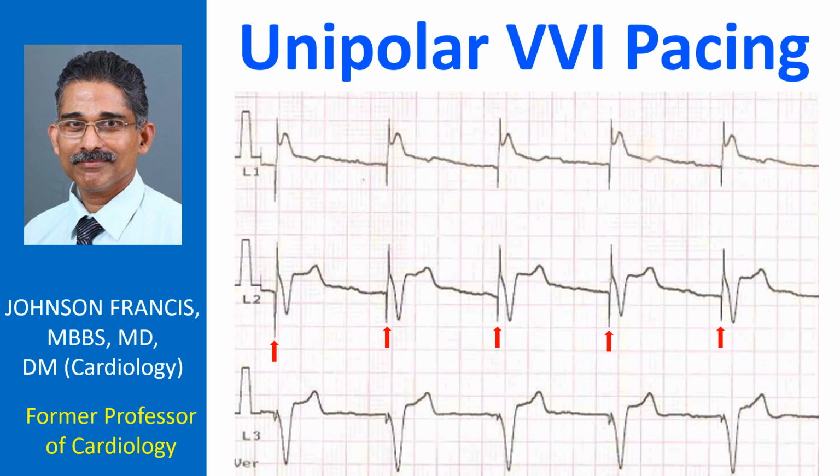Similarly, the sensing of the lead can also be programmed either unipolar or bipolar. Unipolar pacing can sometimes cause local pacing in the region of the pacemaker can. This is more likely if the active side of the can is kept in contact with the pectoral muscle. Usually, the pacemaker is placed within the pocket in such a way that the active side faces the posterior aspect of the skin. This will decrease the chance of local pacing in case programming in unipolar mode is required.